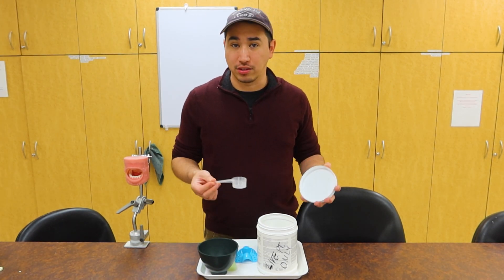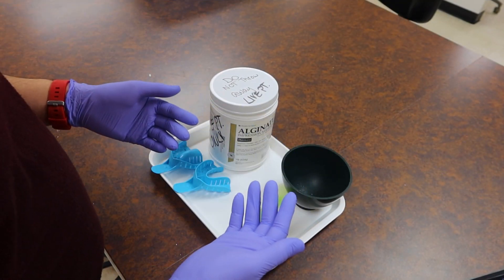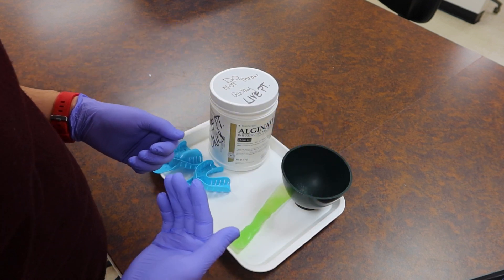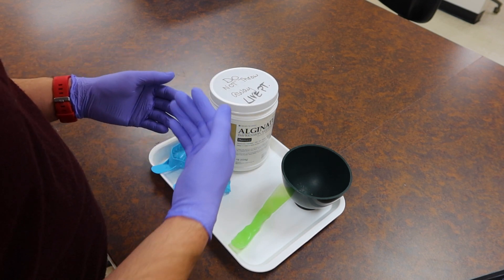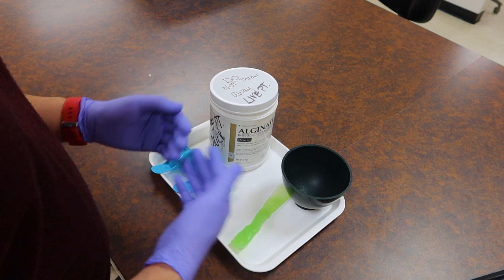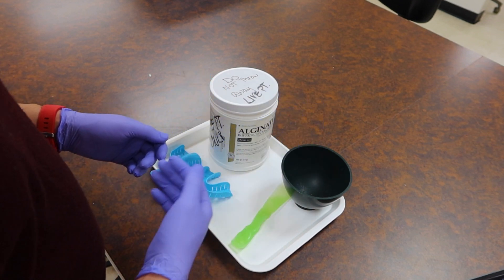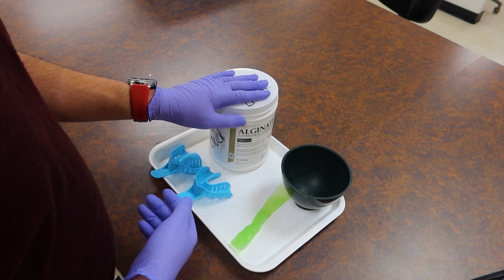Now we're going to go into how to scoop properly. Make sure that when you're handling anything potentially going into someone's mouth, you're always wearing some type of protective gloves. The proper way is to pre-measure how much material you're going to use for that procedure. Since we're usually always taking our impressions in sets, I like to have two bowls so I can have one material for the upper and one for the lower, and I don't have to come back and touch my jar at all after I've done so.